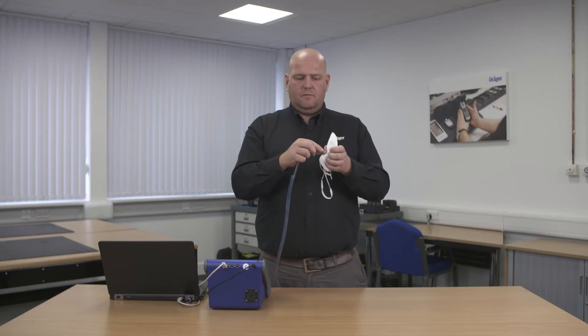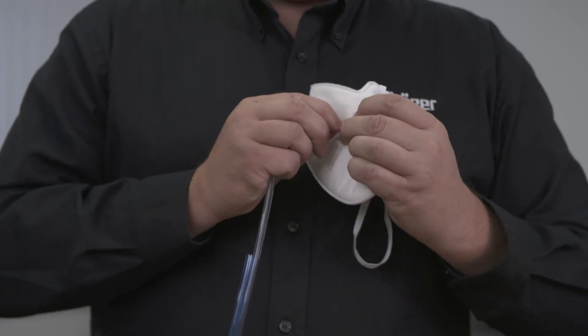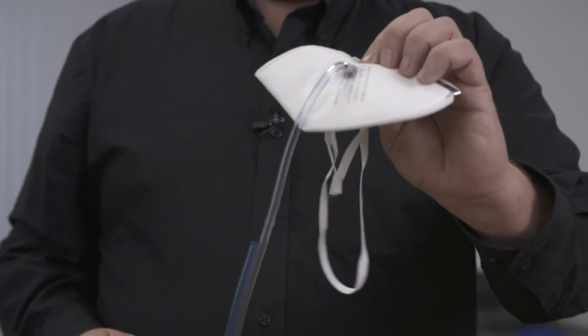Attach the sample hose to the probed mask. The mask is now ready for test.